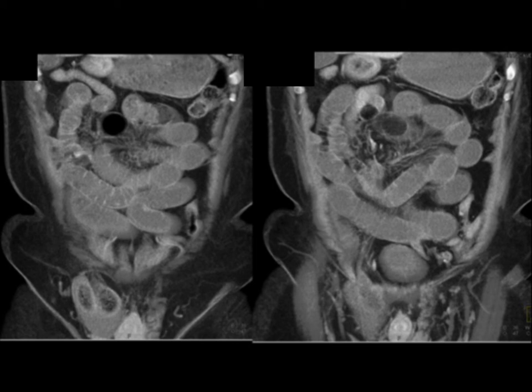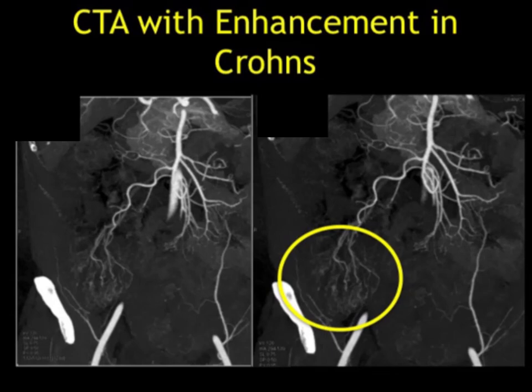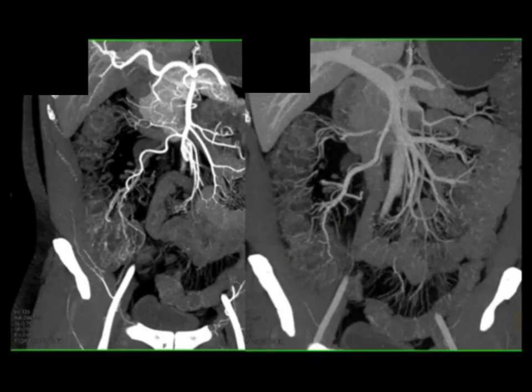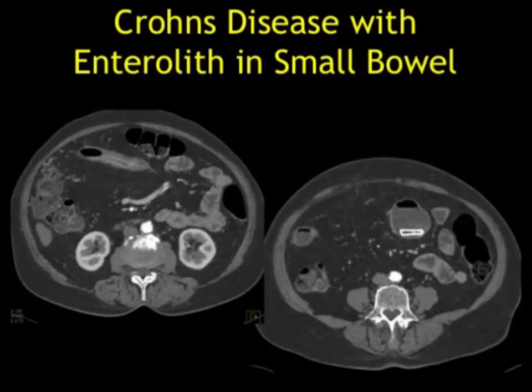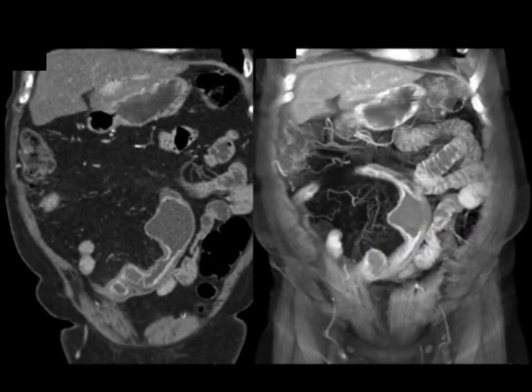Crohn's disease is a very common process and one of the typical presentations is obstruction. You can also get abscess and fistula, but obstruction is one of the most common. Things we see with Crohn's include mucosal hyperenhancement, wall thickening, mural stratification, multiple bowel layers, prominent vasa recta — the so-called comb sign — and mesenteric fat stranding. CT with dual energy is ideal for Crohn's patients. Here we see the prominent vasa recta going to the patient's right colon and distal small bowel, an enterolith present in the bowel, and very nicely a transition point in the small bowel — classic zone of narrowing with partial obstruction developing and an enterolith above that zone, shown nicely in coronals and 3D imaging.